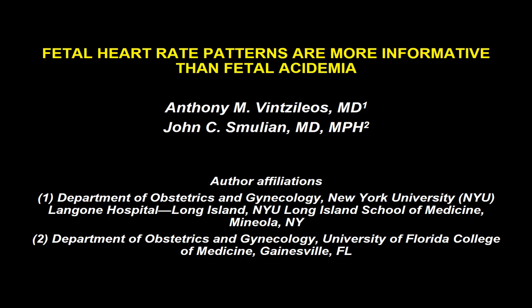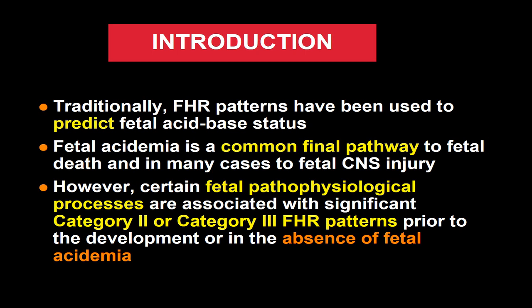The purpose of this video is to introduce the concept that fetal heart rate patterns are more informative than fetal acidemia. Traditionally, fetal heart rate patterns have been used to predict fetal acid-base status at the time of testing. It is a general belief that fetal acidemia is a common final pathway to fetal death and, in many cases, to fetal CNS injury.